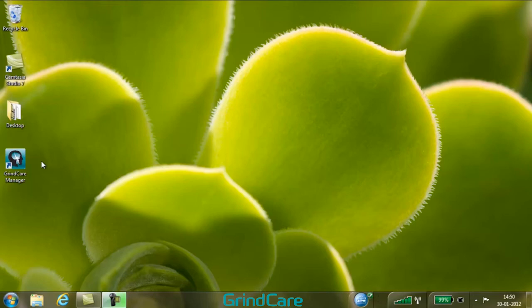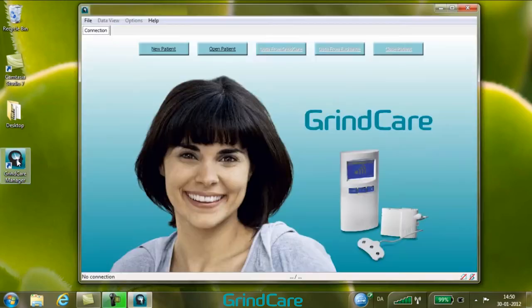To open GrindCare Manager, double-click on the GrindCare Manager icon on the desktop, and the main GrindCare Manager window will appear.